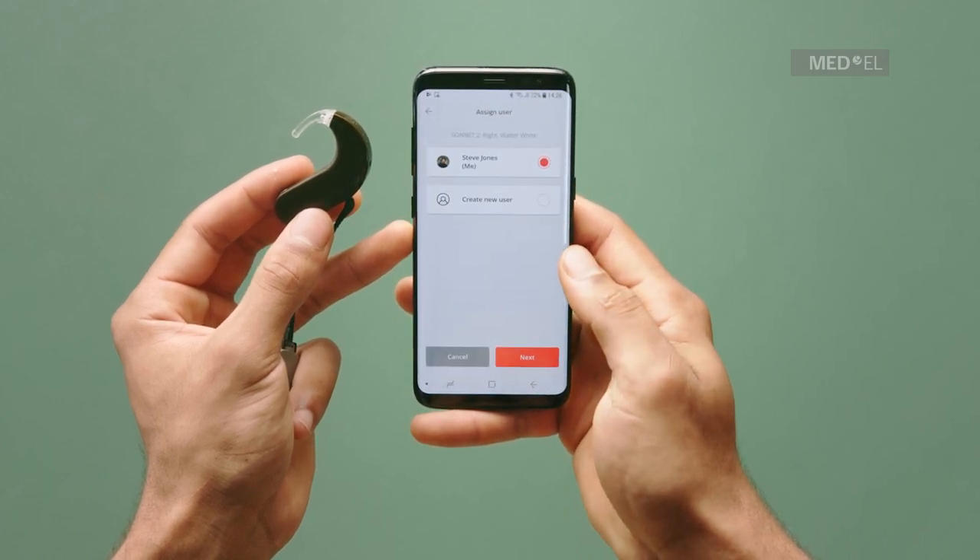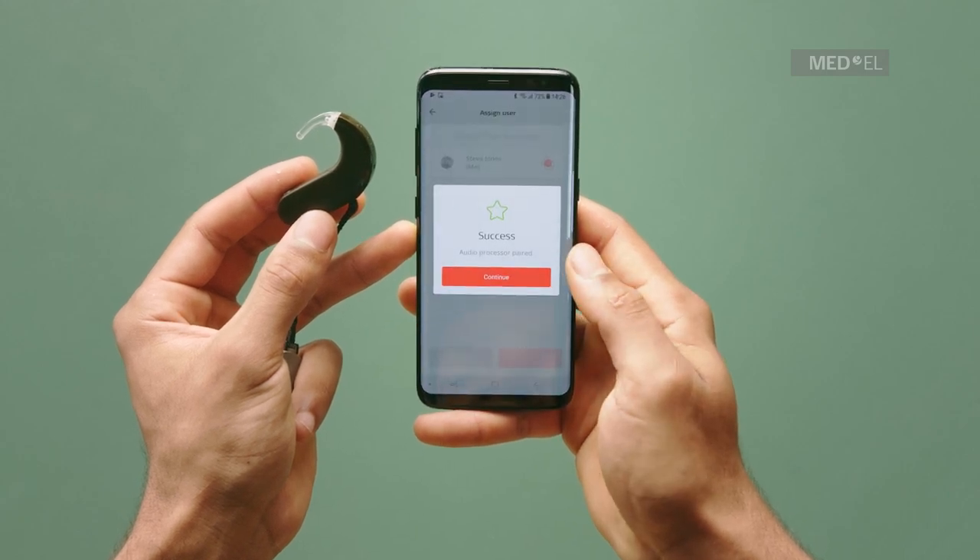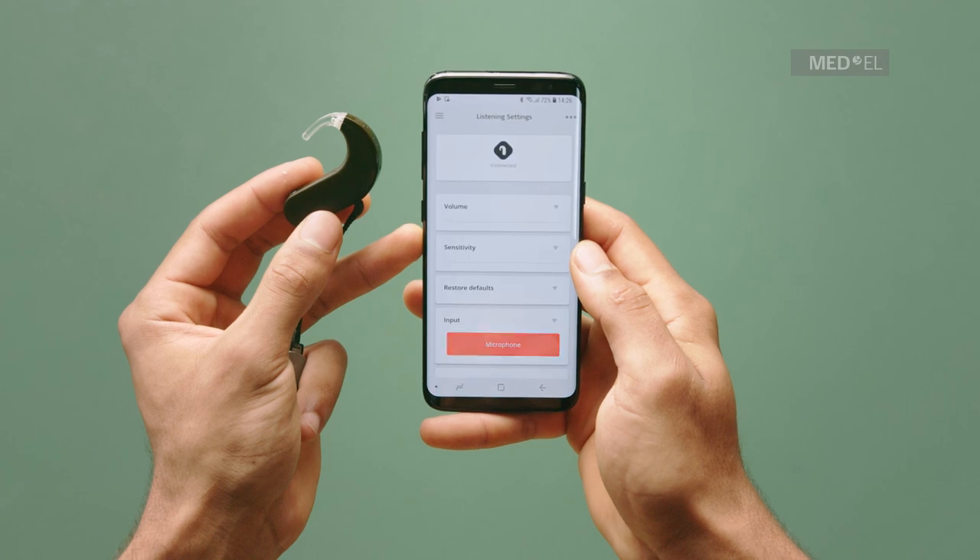Assign a user to the audio processor. If it is your audio processor, select your own account and tap Next.